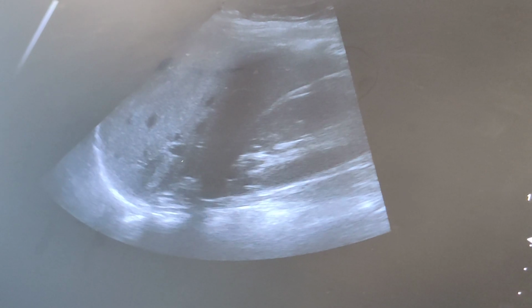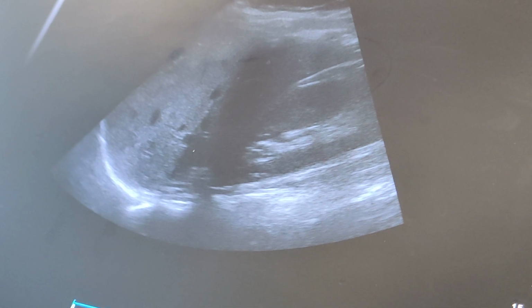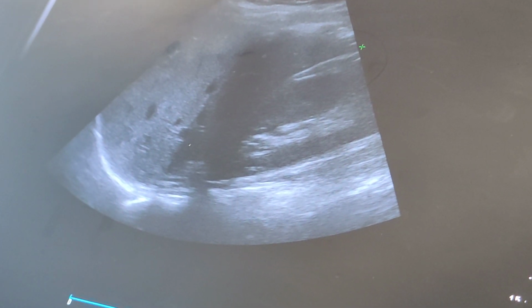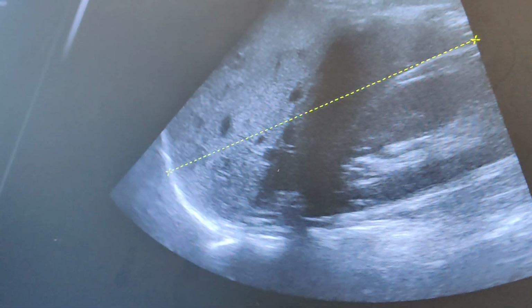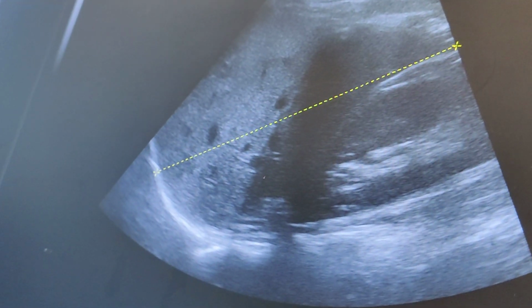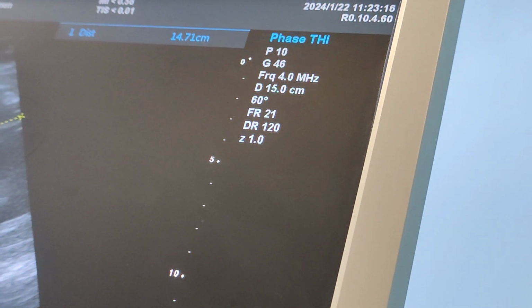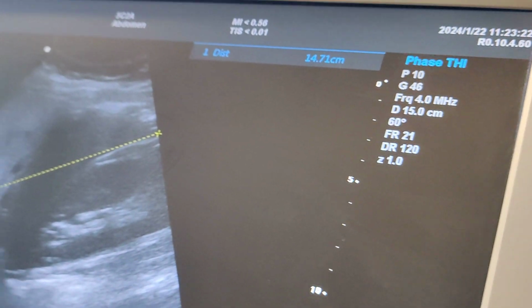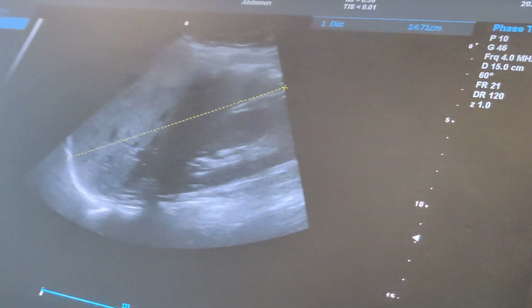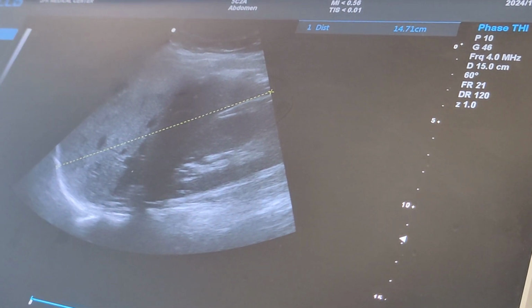Deep breath. So when you're measuring, you'll hit your caliper. You want to measure from the inferior edge all the way back to the superior area. Try to get a long measurement. So 14.7, that's pretty normal. The criteria used to be 15 centimeters or 150 millimeters. I think a lot of places now have increased it to 16 centimeters or 160 millimeters being normal.